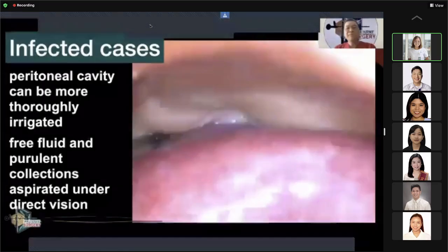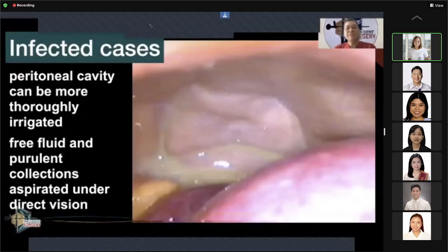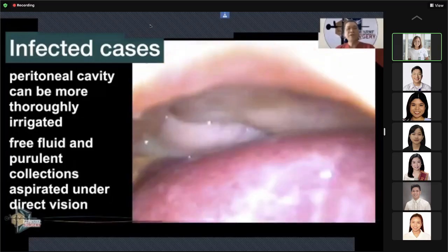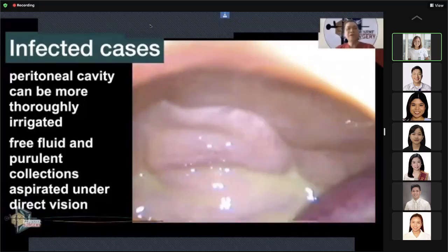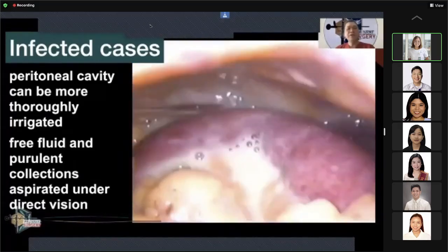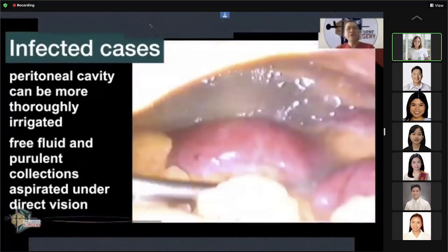So through laparoscopy, you can wash the entire peritoneal cavity without making a big incision. And then you remove the appendix. So the advantage of this is you do not touch the bowels, you do not inflict more inflammatory process. And even if you have this type of peritonitis, you expect your patient to ambulate at the earliest on the second to third day, better than open surgery.